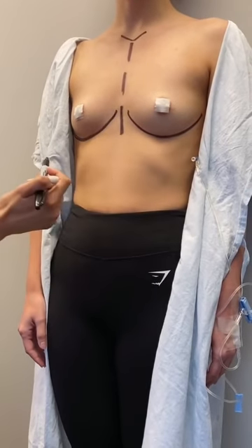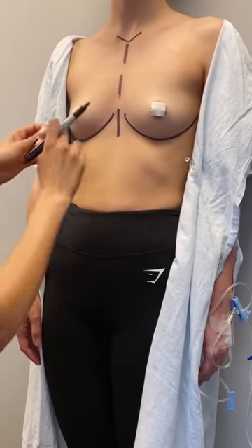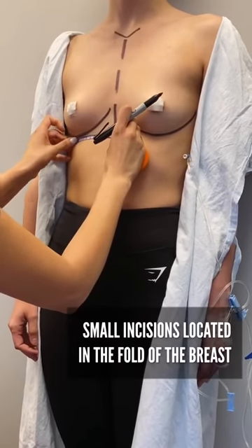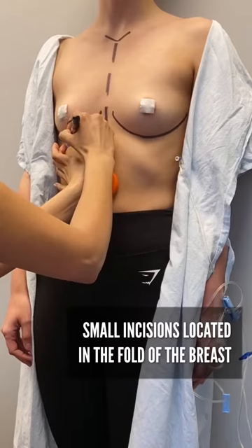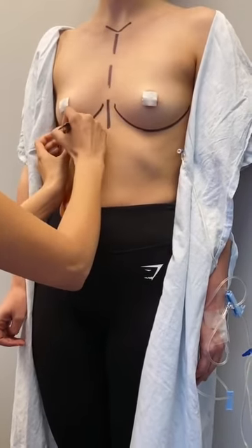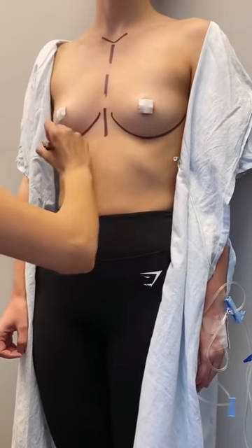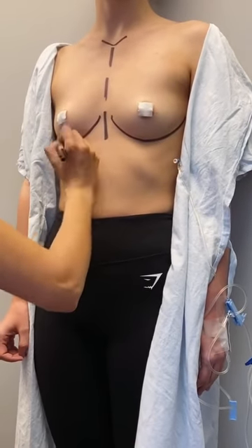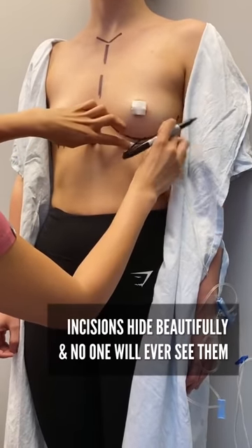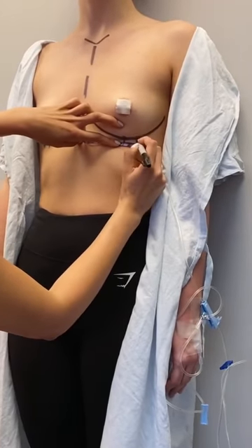What I'm marking right now is her inframammary folds — that natural crease — and her incisions are going to be located right in that fold. I make my incisions about two and a half centimeters, so they're very small. They hide beautifully in her skin crease after surgery and no one will ever see them. I like to measure to make them nice and symmetric, perfectly even.